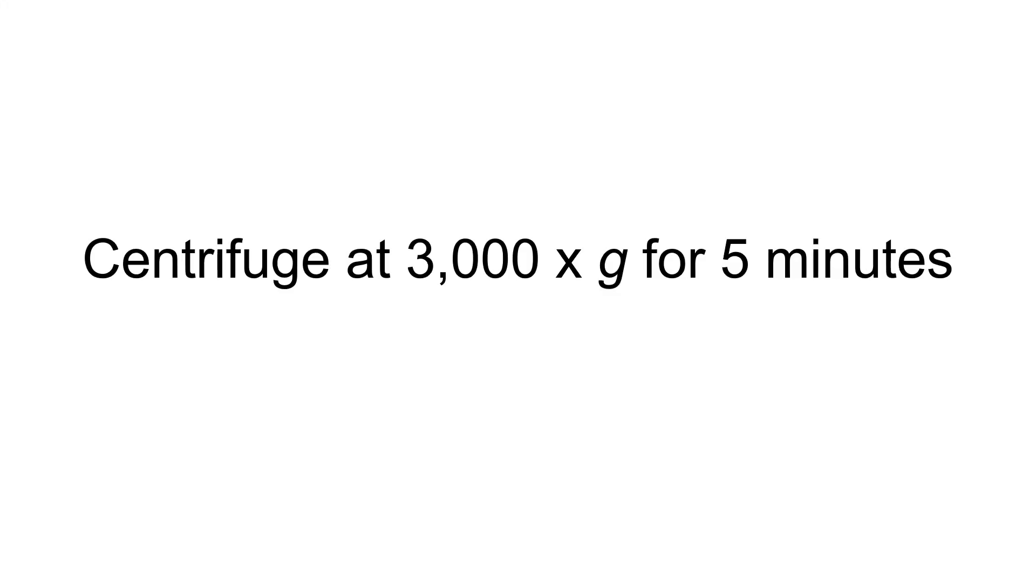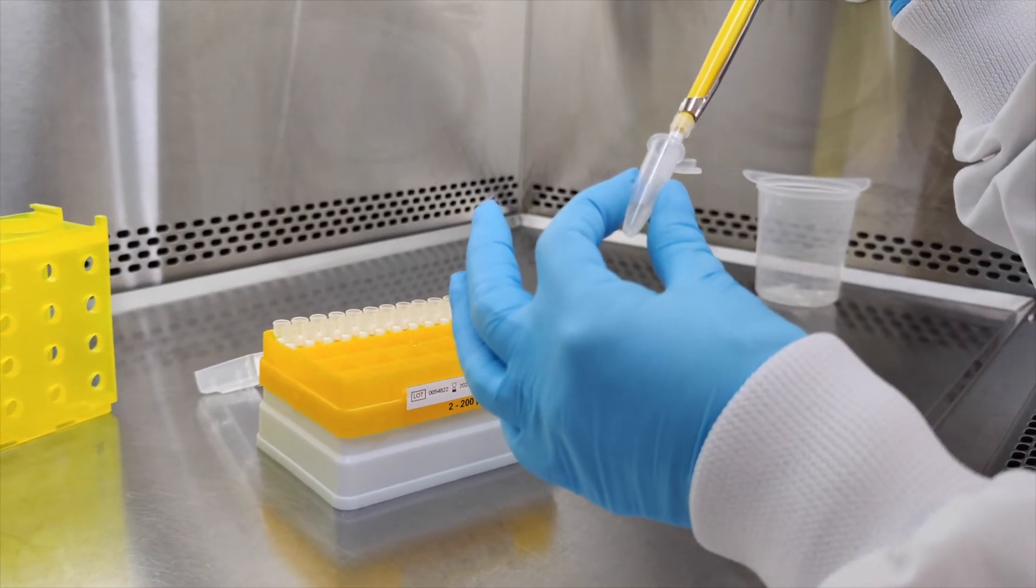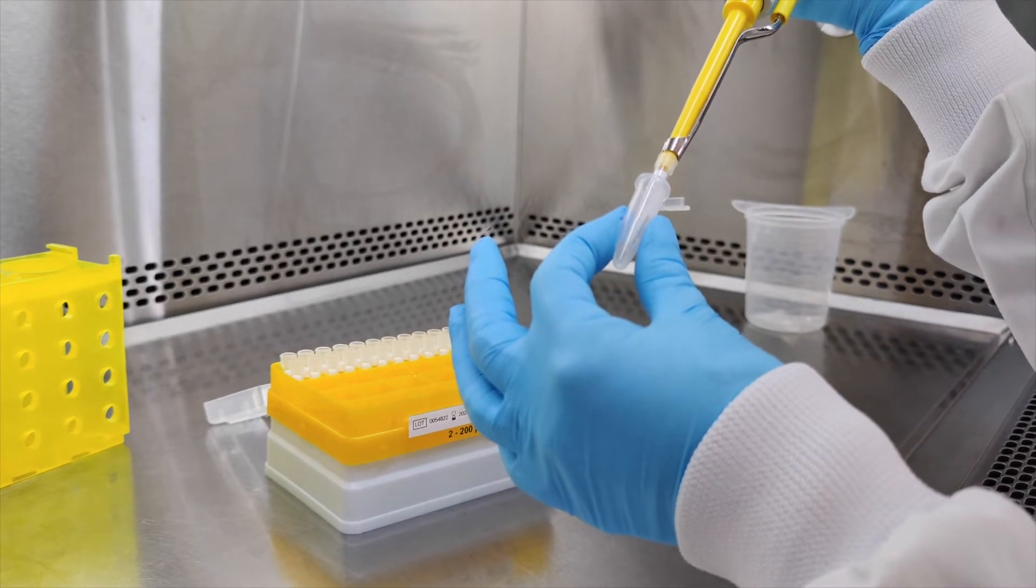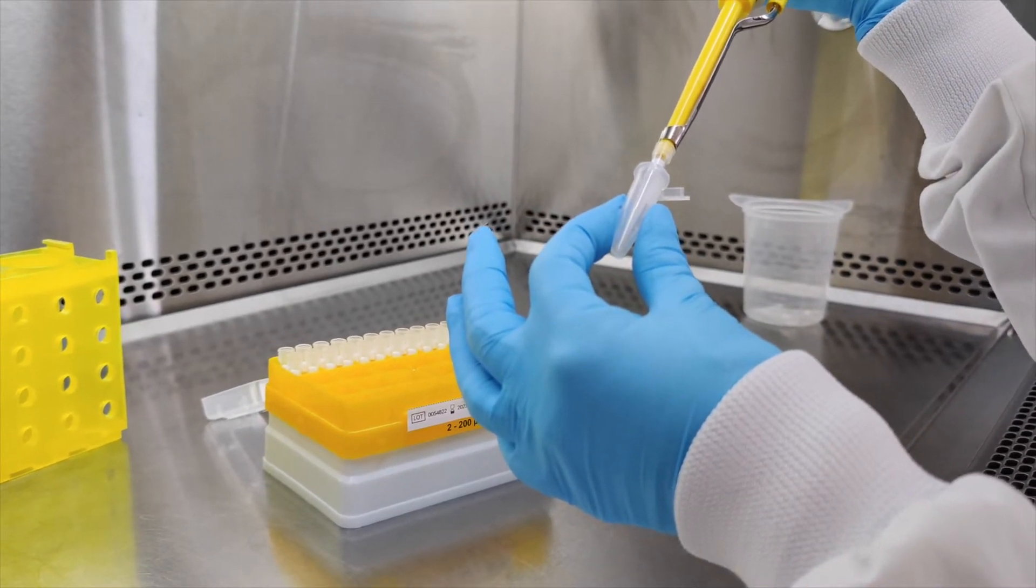Centrifuge pod suspension at 3000 g for 5 minutes. Being careful not to disturb the pods pellet, remove and discard the supernatant.